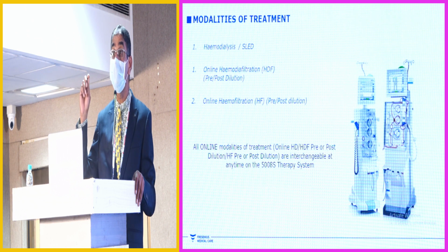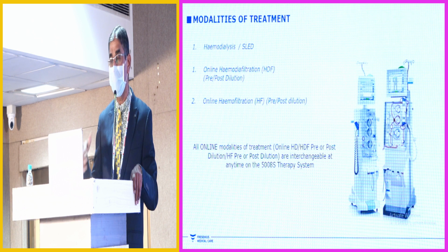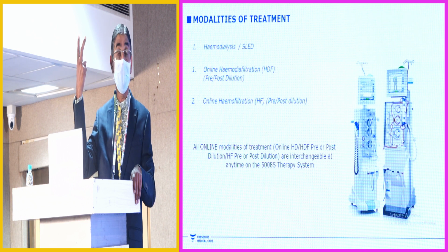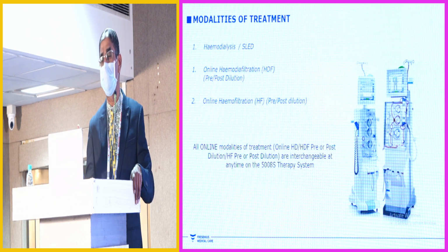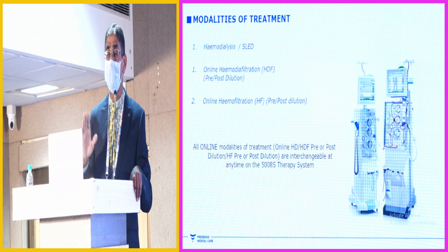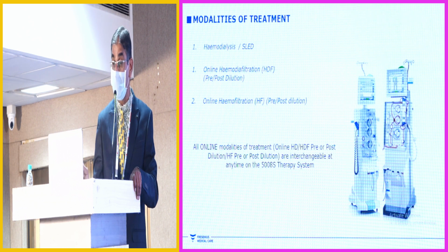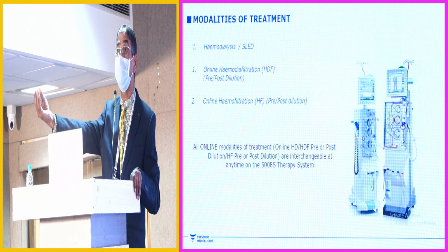What do I mean? I'm not telling you to do it every week, I do it every week. Right from 87, we were doing it with formaldehyde. Now we have peracetic acid. You no need to wait for 24 hours. It's just 1.5 hours, you finish your disinfection. And whatever you do with the right disinfection time, the ultrapure water is made available at the membrane outlet.